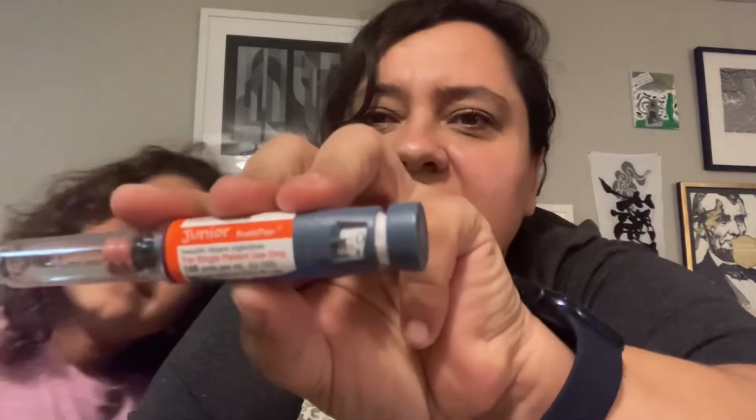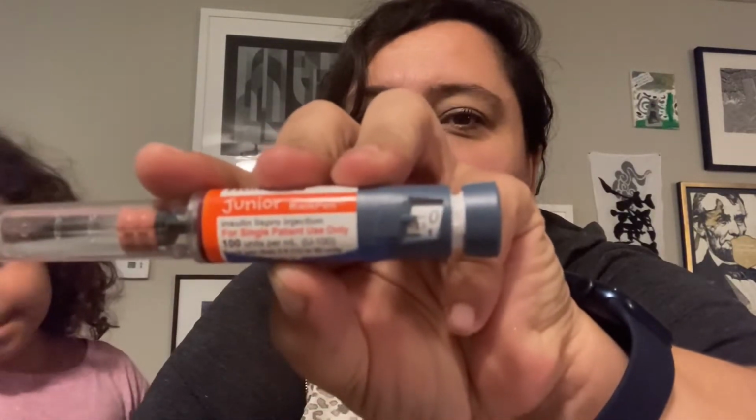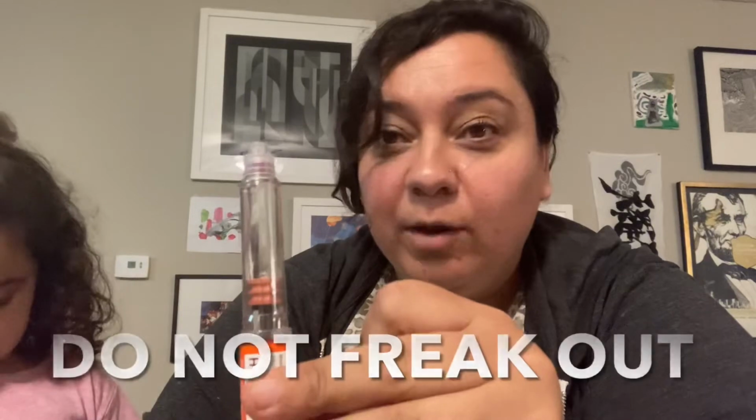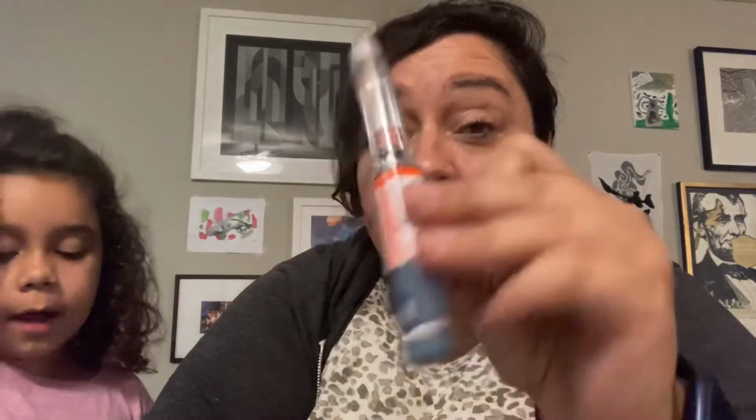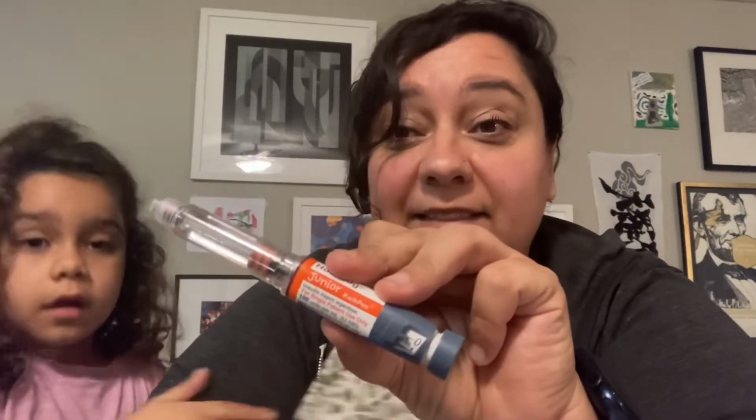Okay, so now we're going to show you how to prime the needle. You're going to see that this says 0. That's where you want it to be. In order to prime the needle, we're going to make sure there are no air bubbles in the chamber. Now, don't freak out. Air bubbles will not harm a type 1 diabetic because this is a subcutaneous injection, not an intravenous or intramuscular injection. But we need to make sure that there are no air bubbles in the pen so that we get the correct dosage of insulin.